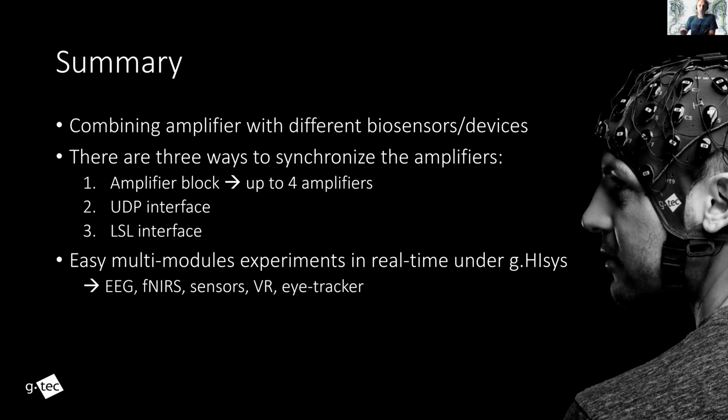When the EEG traces are already good, why do you actually need the EMG test by clenching your teeth? It's just a test of the artifact. It's not necessary, but it's one of the field steps I usually do to test the response time and whether signals are really reaching.